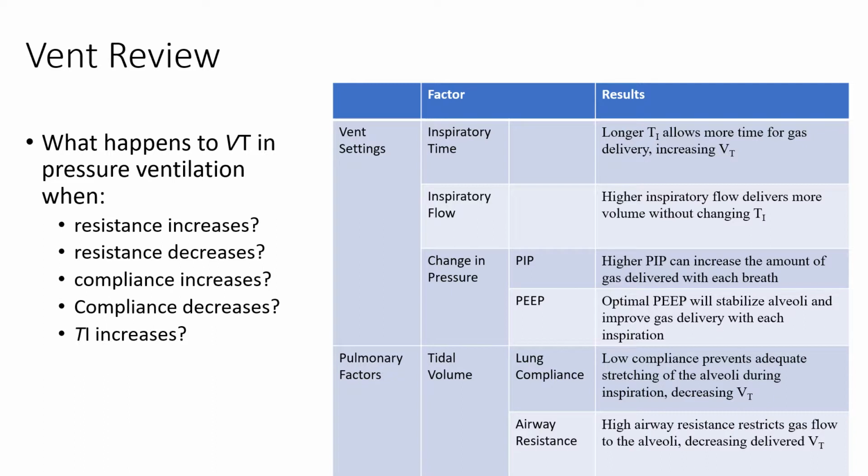Okay, this is our last slide on review before we go on. So the table here just shows you, with your vent settings, how your inspiratory time, inspiratory flow, and change in pressure are going to affect your overall patient outcomes. So if you have a longer I time, it's going to allow for more gas exchange, which will increase your tidal volume, and it will improve your oxygenation.